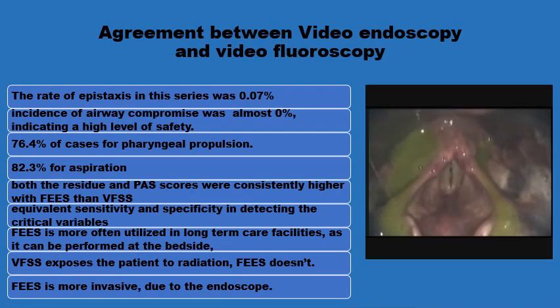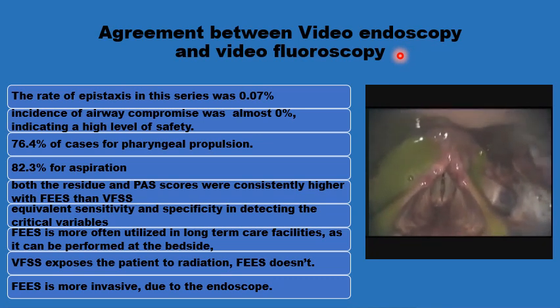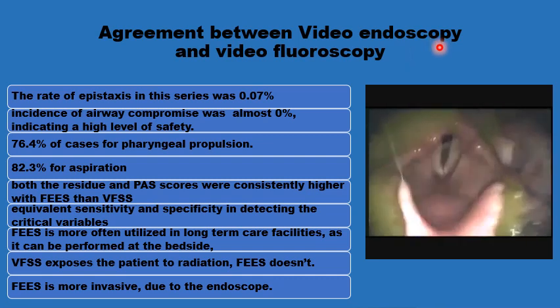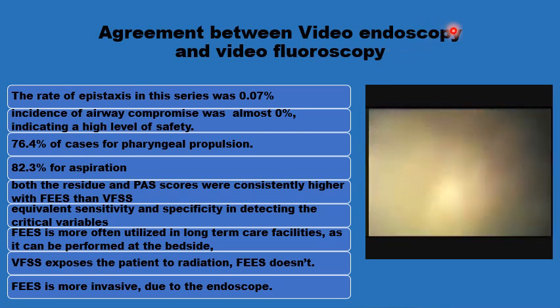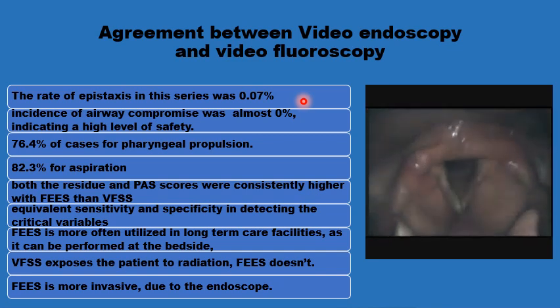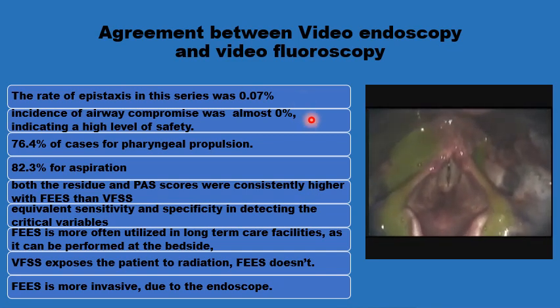Video endoscopy and video fluoroscopy complement rather than compete with each other. There will be patients in whom a video endoscopy can bring about more information and others in whom video fluoroscopy would be better. Video endoscopy is a fairly safe procedure. The rate of epistaxis is about 7 in 10,000. The incidence of airway compromise during the FEES examination is next to zero.